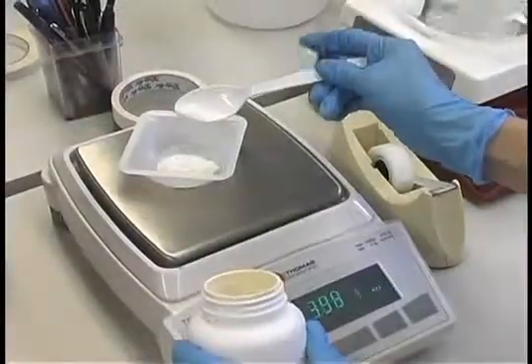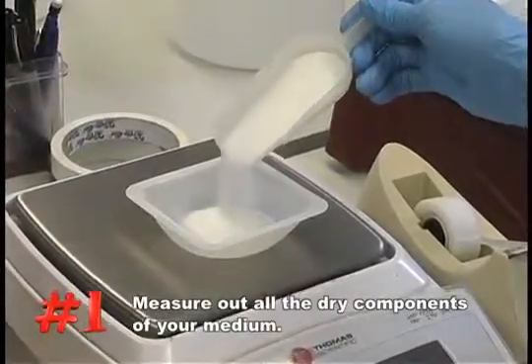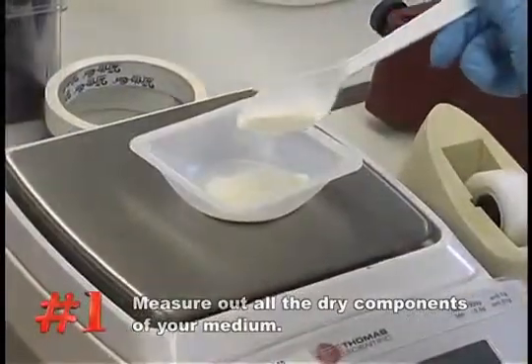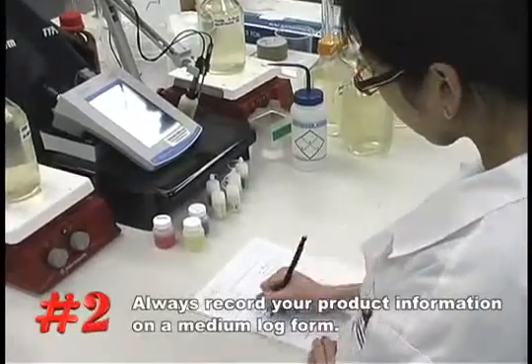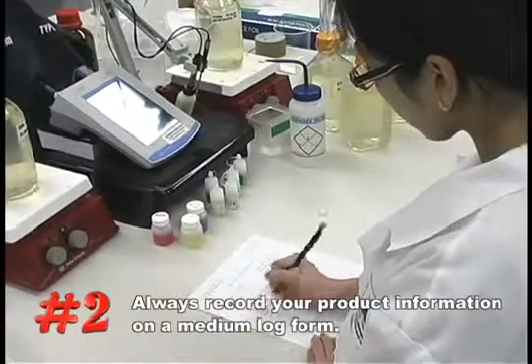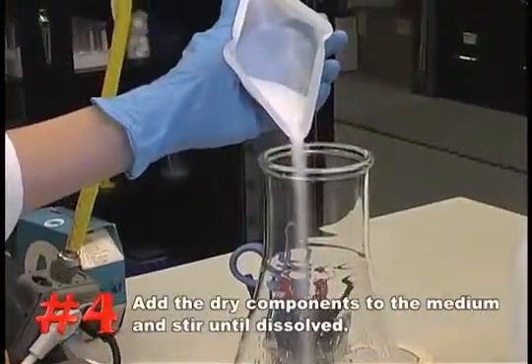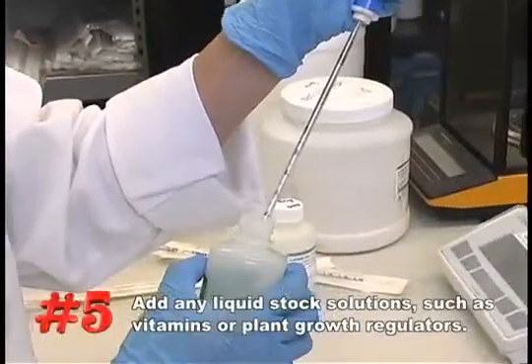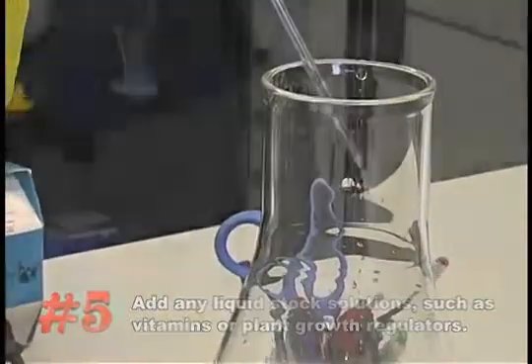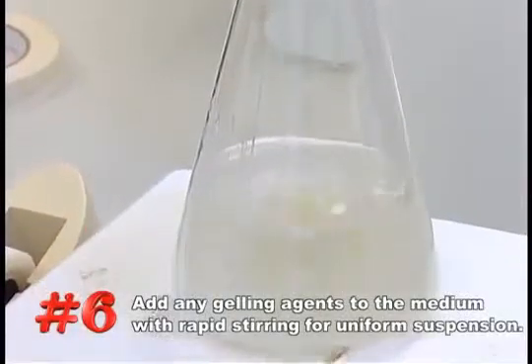To recap: Number one, measure out all the dry components required — using a pre-formulated dry powder medium will reduce the number of components to be weighed and reduce the possibility of error. Number two, always record your product number, lot numbers, and weights on a medium log form. Number three, measure out 80% of the final volume of water to be used. Number four, add the dry components to the medium and stir until dissolved. Number five, add any liquid stock solutions such as vitamins or plant growth regulators. Number six, slowly add the gelling agent with rapid stirring to obtain a uniform suspension.